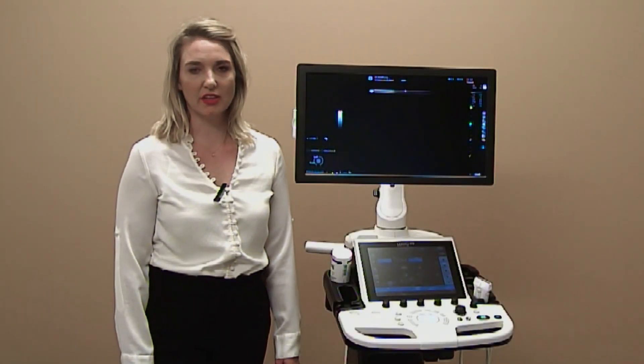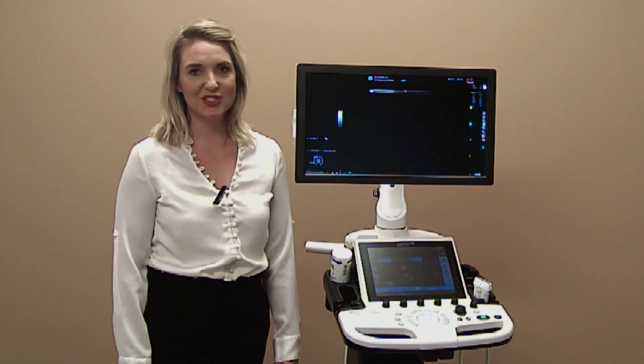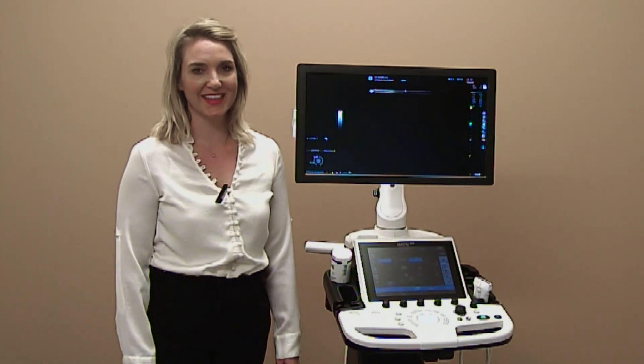Hi, I'm Beth, Point of Care Clinical Application Specialist for GE Healthcare. I'm excited to show you how to use the Logic P9 Ultrasound Machine.